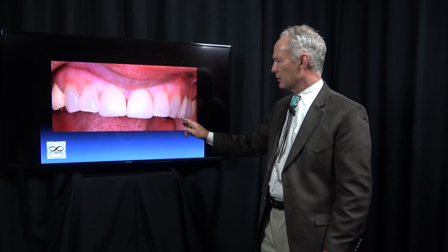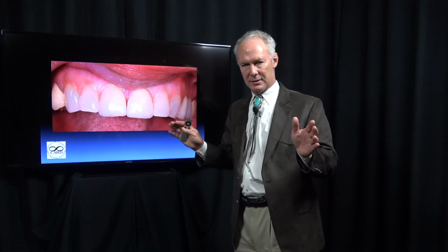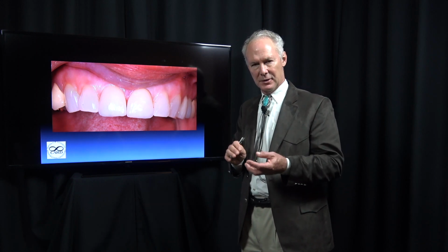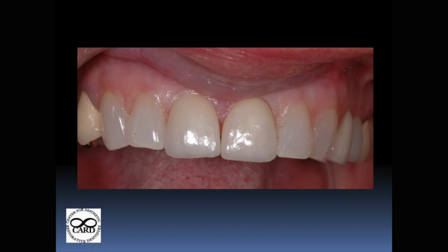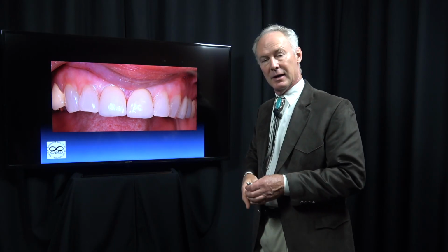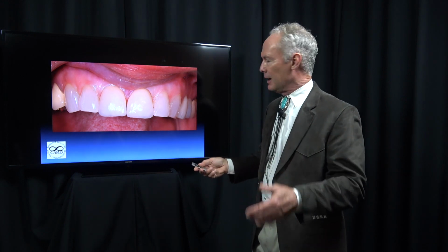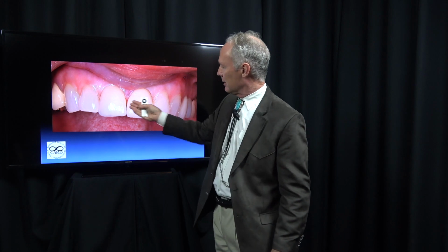Now, this is the critical part. I don't ever use try-in paste because the shade of the cement is not determined until it's set. Place the veneers on the teeth and see how they look on the teeth with no cement. If the shade is perfect, then we're going to use a translucent cement. If they're a little too light or a little too dark, I'm going to use either a little lighter shade cement or a little darker shade cement.